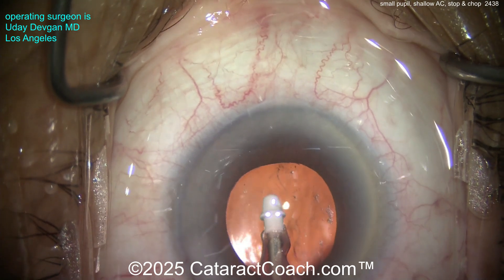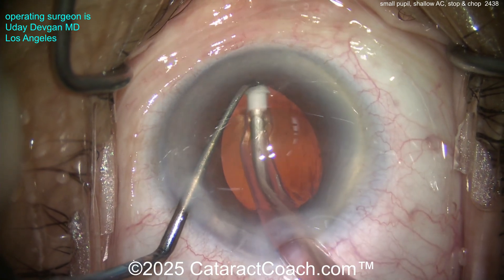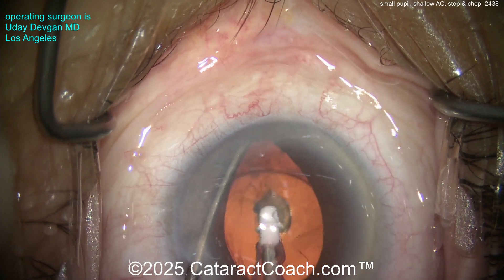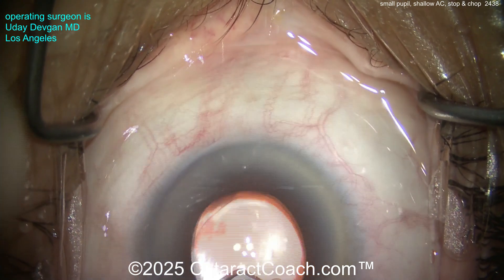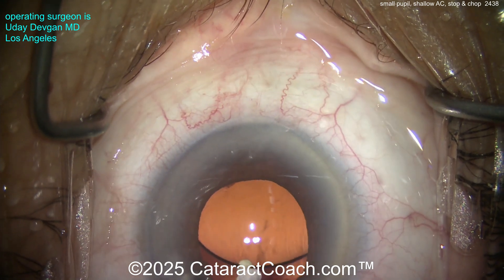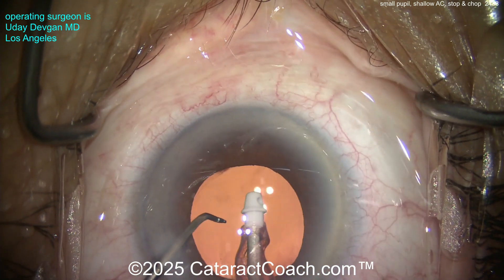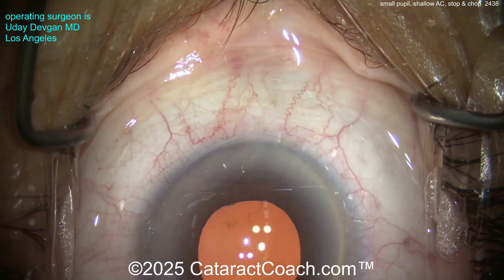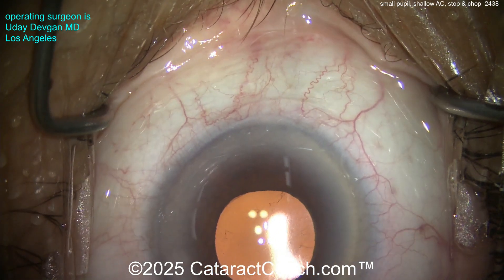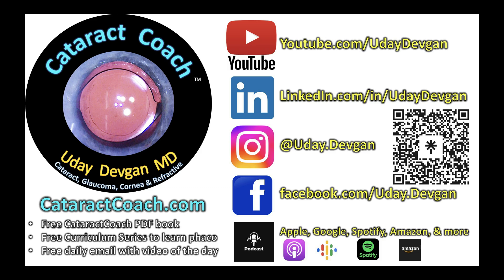Using the coaxial I&A probe in one hand and the chopper in the other, let's lift up the iris to expose that area — and aspirate it out. Don't aspirate the iris — there you go, get that out nice and easy, beautiful. If you had left that in the eye it would have caused tremendous post-op inflammation. This is why you have to check. Going behind the lens to confirm, centering the IOL on the visual axis — that's good. Center the microscope. Beautiful outcome. Patient is so relieved, I'm so relieved, and my good friend the referring ophthalmologist is so relieved. All's well that ends well. Remember to check out the podcast — it's everywhere you can find podcast services.